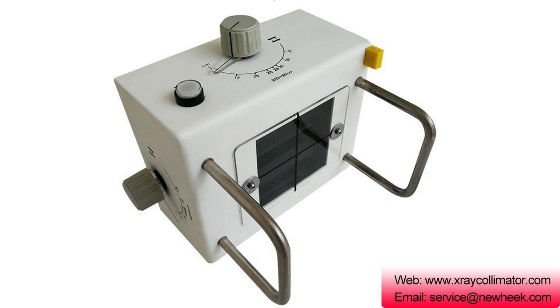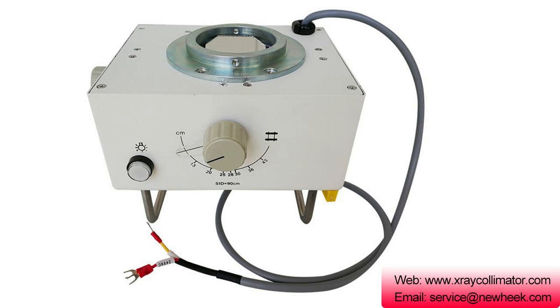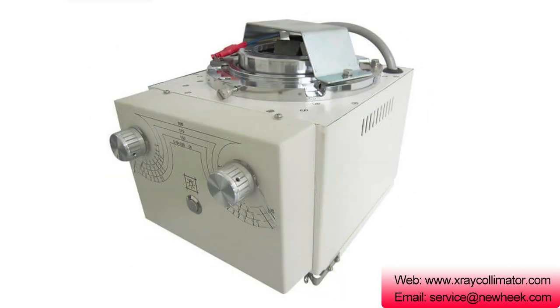Newheak has three main X-ray collimators for filming. The NK-102 is suitable for 125 kV tube in mobile or stationary X-ray machines. The NK-103 is mainly used for 125 kV tube and portable X-ray machines.